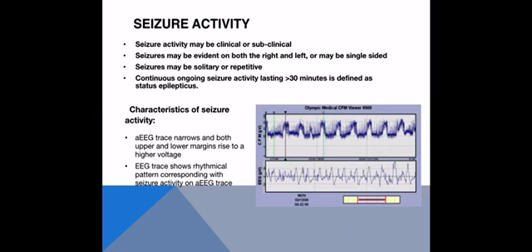So what do seizures look like on the CFM trace? If we look at the trace here, we can see that the upper and lower margins both rise or spike up to a higher voltage, and the raw EEG below shows a rhythmical pattern that corresponds with what we see on the AEEG or CFM at the top. A pattern like this is sometimes referred to as having a sawtooth appearance.